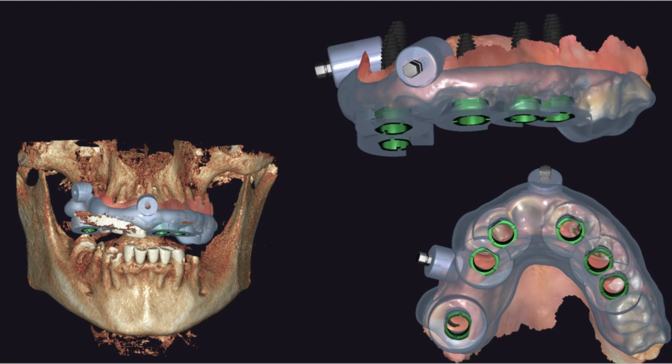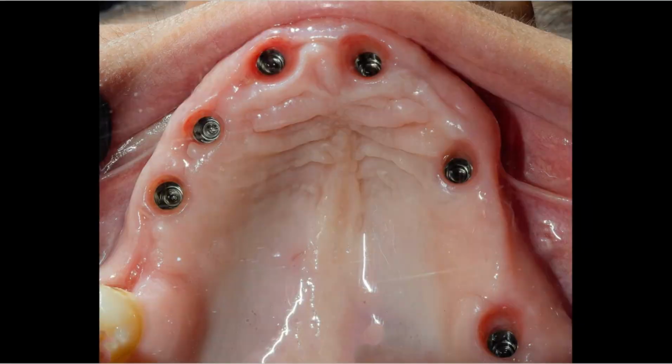Here is a surgical guide fabricated according to our plan. To support the surgical guide with lateral horizontal fixation so we can make sure that our plan will be real without any minor deviation. Here is the final result as planned before. No surprises, I know what I will exactly do from the prosthetic phase.